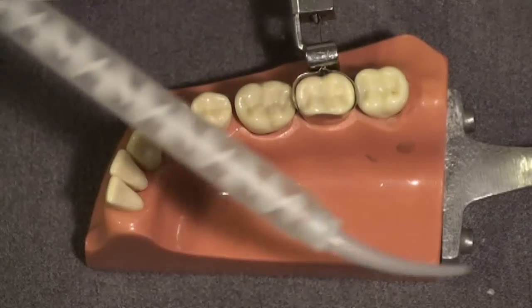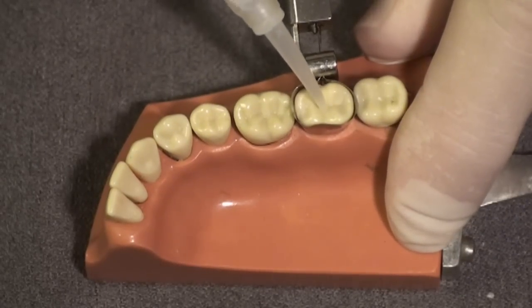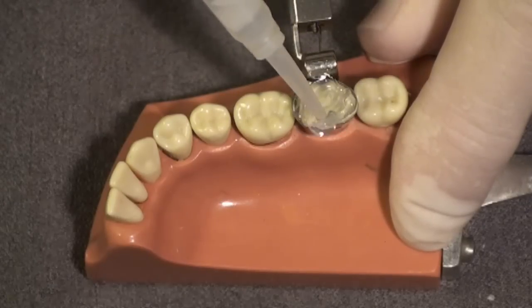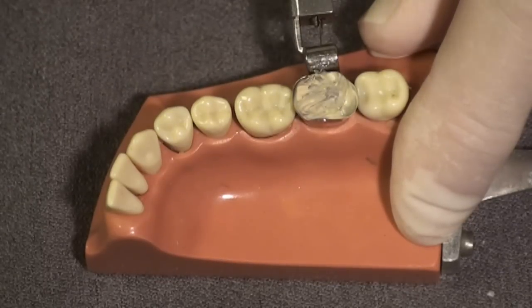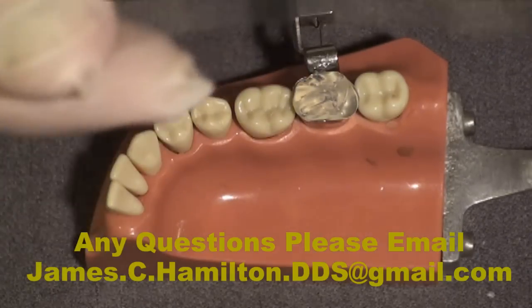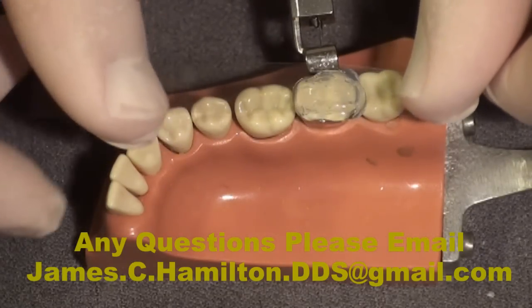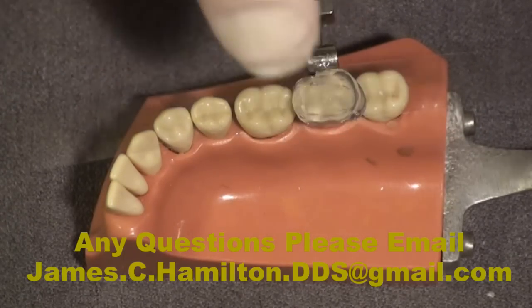We then take a clear bite registration material in a cartridge and inject that onto the tooth, moving the tip through the grooves as we inject and then around the embrasure where the band meets the tooth. When I take that away from the tooth I leave a surface that is not smooth, so I now take a mylar strip and lightly place that on the unset clear bite registration material.